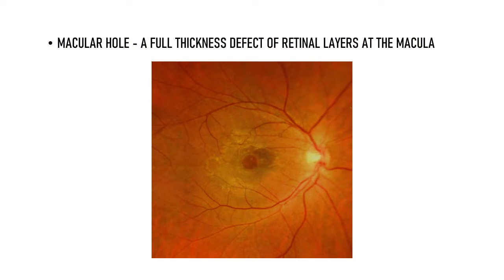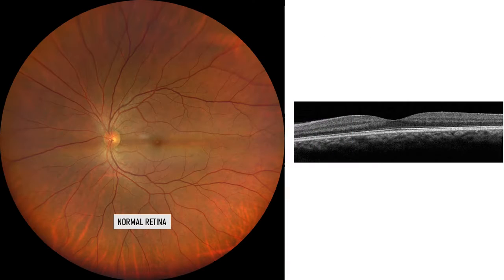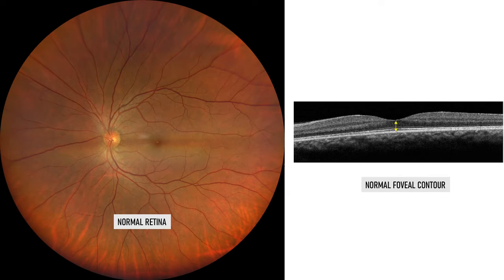Macular hole is defined as a full thickness defect of the retinal layers at the macula. Let's see this image. This is a normal retina with a normal foveal contour on OCT. All the retinal layers in the region of the fovea are intact.